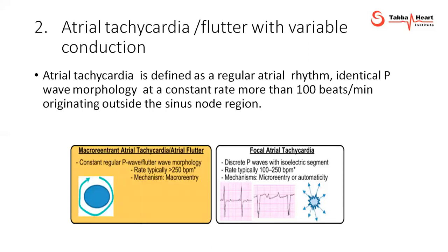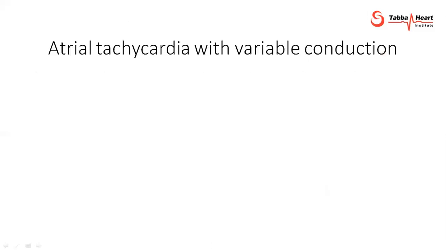a lot of cardiologists and general physicians are still using flutter and atrial tachycardia because they don't know that the guidelines have actually changed. It is a mechanism, and you may not be able to distinguish the mechanism on just a 12 lead ECG. The history, and sometimes EP study and entrainment, will tell you. There is more on history than on ECG.